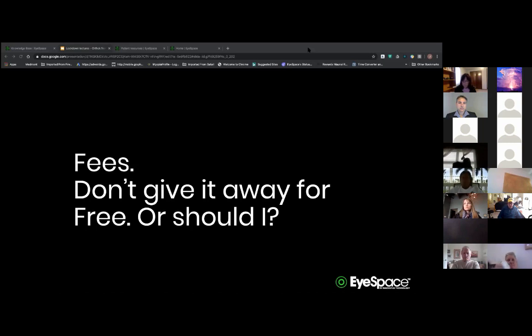From there, we also make sure we remind people about things like spare lenses, and we start the conversation at the beginning. It's a good idea to consider those from the beginning, so then they know that they may be up for some extra lenses later on.